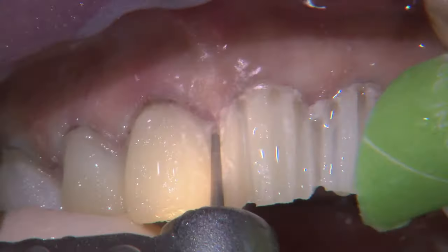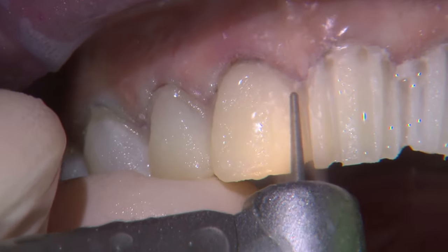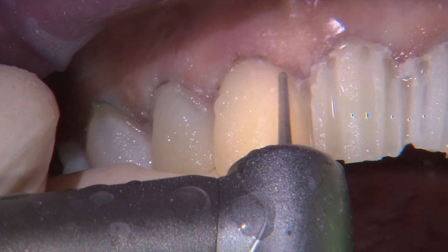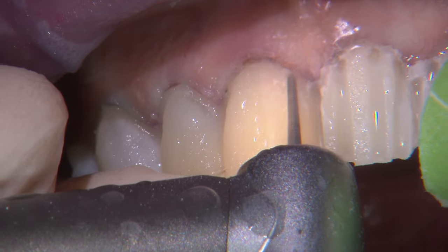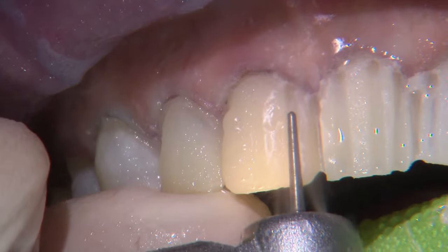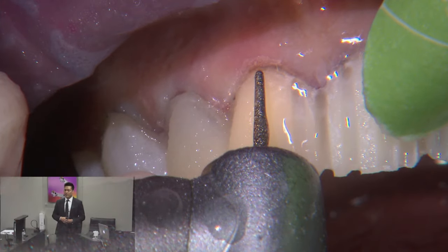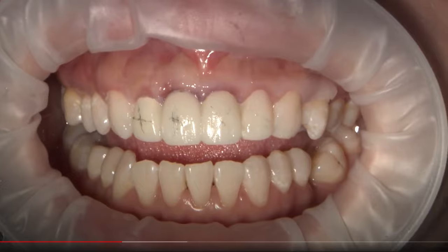From that mock-up, I also love using it for the preparation. You saw that formula of removing anything too facial, removing anything too incisally. Once you've removed and pre-contoured those areas that are too far in those dimensions — incisally and facially — then when you choose a prep bur, I recommend a round-ended tapered diamond bur to create depth cuts, these vertical depth cuts.